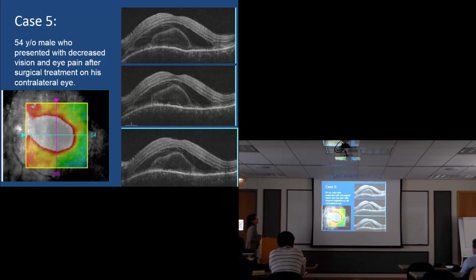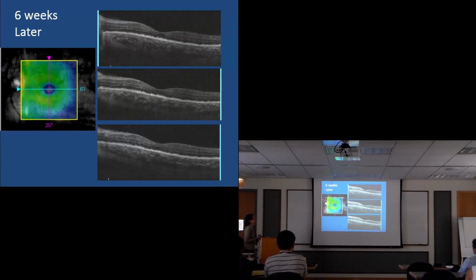Case number 5 is a patient who came in with a rare condition that happened after he had surgery on his other eye. This eye started to get blurred, and this is also subretinal fluid, but so thick, and this is where this condition is inflammatory. So we saw so many different types of fluid. This one really has macrophages involved, we think. An inflammatory response is called sympathetic. His vision might be able to see hand waving before 1 week, 6 weeks of steroids and totally gone.